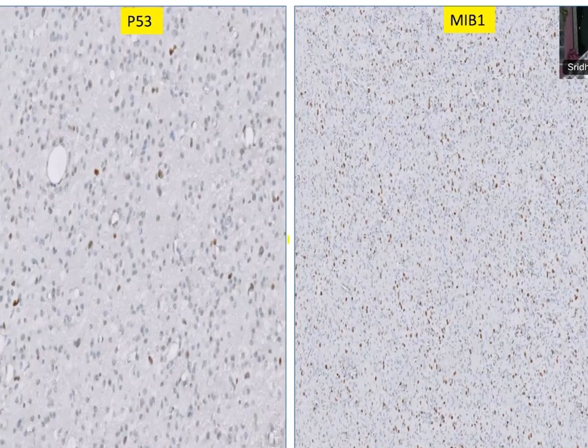So what is the P53 showing? Retained? Negative? Positive? No, it is not negative, so you don't have to say negative. Some cells are there, but less than 10% of the cells are strongly positive. So it is not a typical P53 mutant pattern of protein. So this finding also cannot tell you whether it's an oligo or not an oligo, or an IDH wild type glioblastoma. Maybe as expected, it is higher.